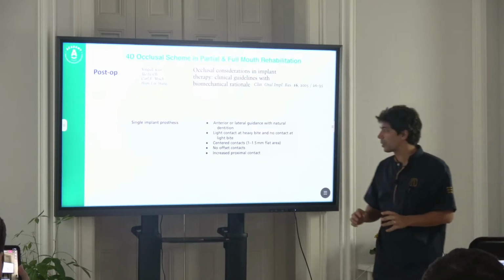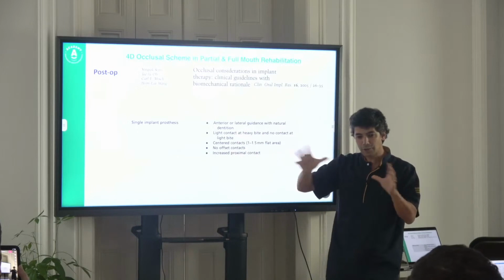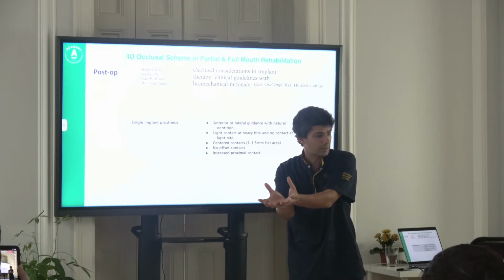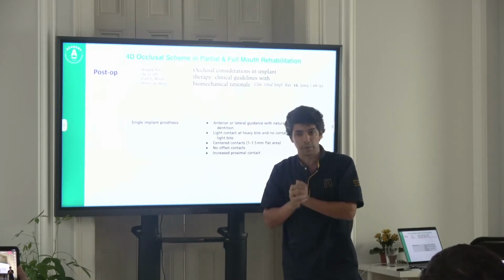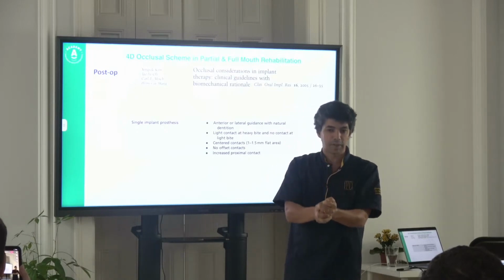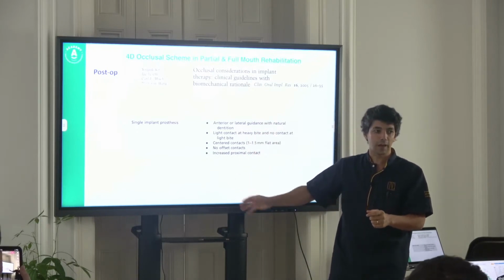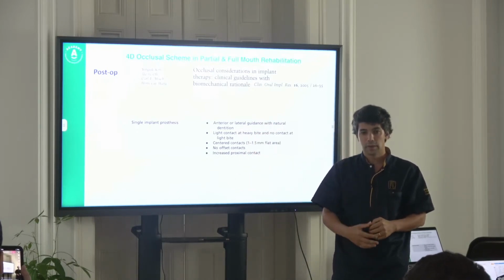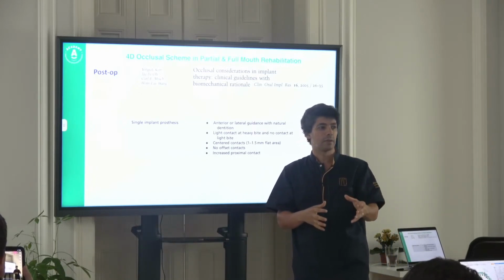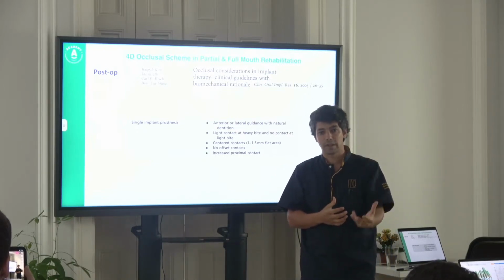Then in single implant prosthesis, of course, we will use a natural dentition to get stability for our single implant and single unit rehabilitation. And what we have to know is that in specific cases like this one, it is crucial that we have an annual control so that the occlusion can be checked digitally every year and we ensure the good stability of the case throughout time.